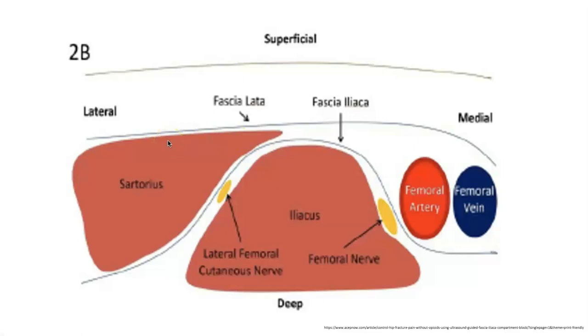Our two fascial planes relevant to the procedure are the fascia lata, which is superficial to the sartorius, and the fascia iliaca, which runs between the sartorius and the iliacus muscle. Just beneath the fascia iliaca, you can see the femoral nerve and the lateral femoral cutaneous nerve, which are two of the three nerves affected by this block.